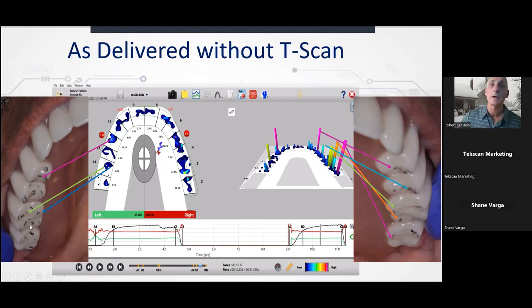And the other marks, obviously, they can be artifact, they can be ink smears, and most of them are low force and hard to judge. Like this is the most distal lingual contact. That's going to be this one here, right? And that's how you do it, right?